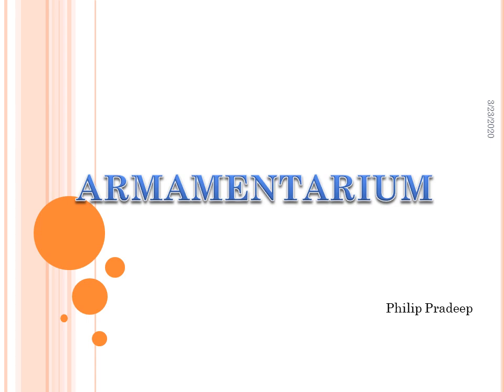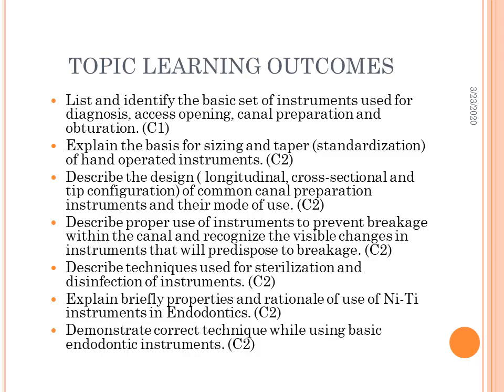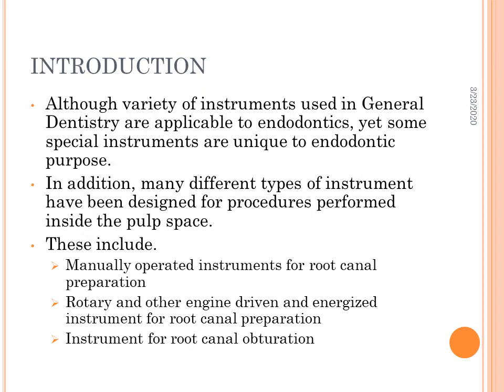Today I'm going to be talking about the armamentarium, which is commonly used in the RCT. These instruments are specific and unique because they allow you to perform treatments inside the pulp space. So obviously they're going to be very small in size.